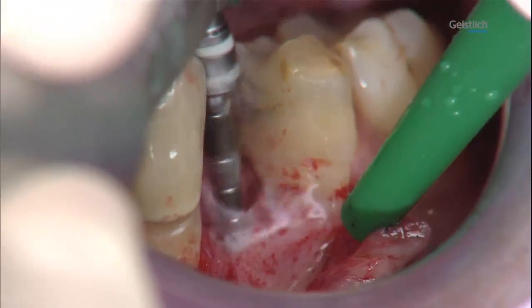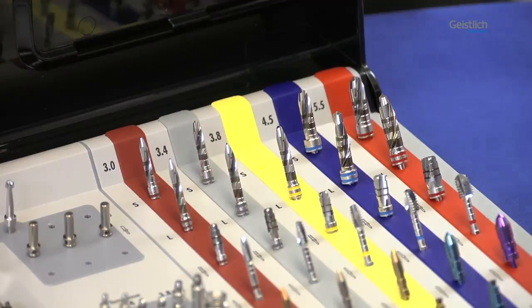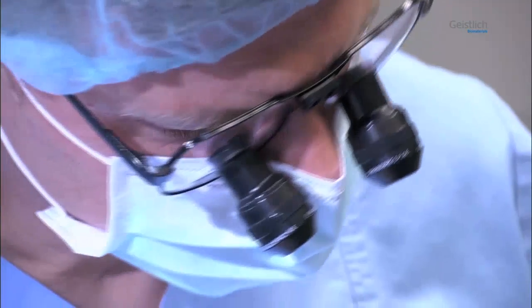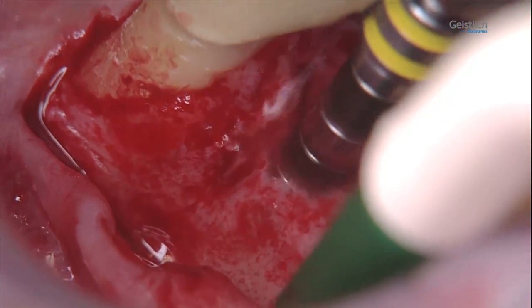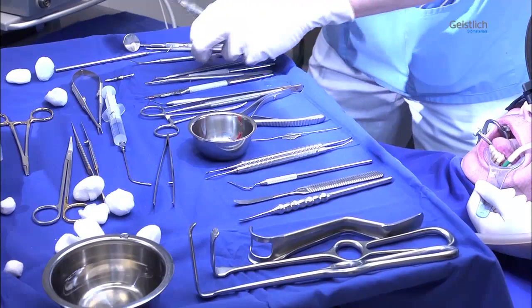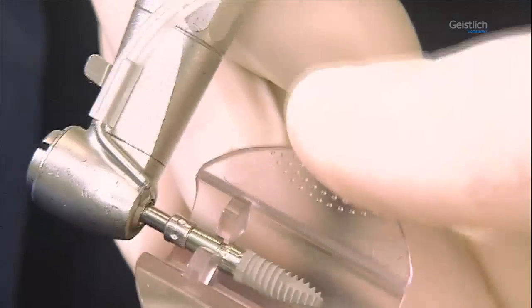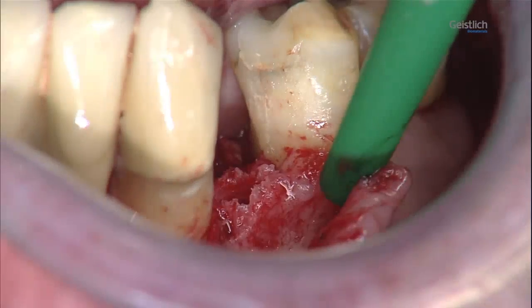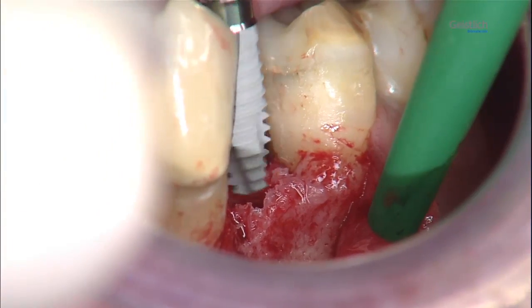The pilot hole is now complete. We finalize the implant bed with a concluding round of irrigated drilling. The implant and its insertion tool are removed from their sterile packaging and mechanically screwed into the implant bed at low speed, following the implant manufacturer's instructions.